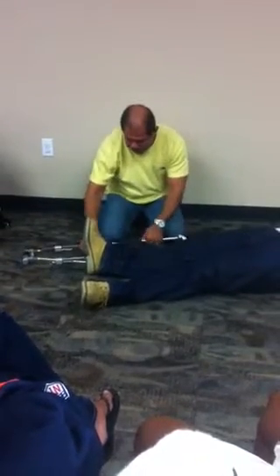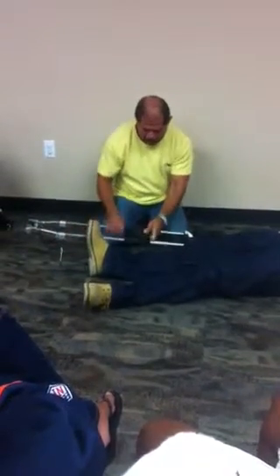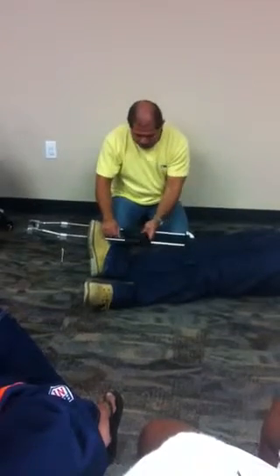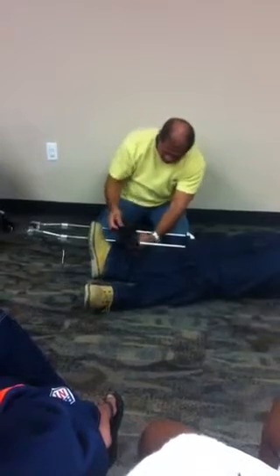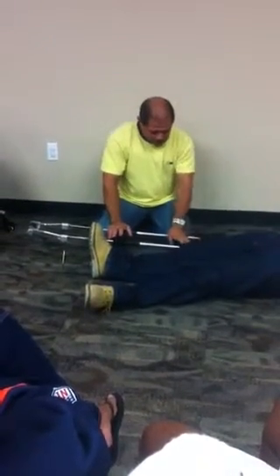And I don't know if you can see that these black knobs are in my way, and I won't get that over. So I come back behind it. That's probably the easiest way to move those if you have to. Most of the time you can slide these.